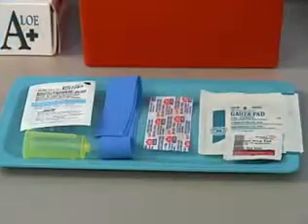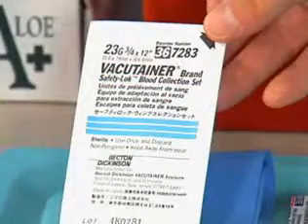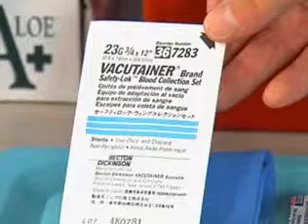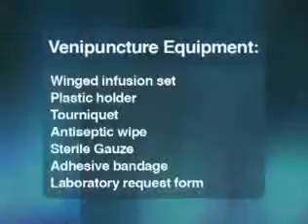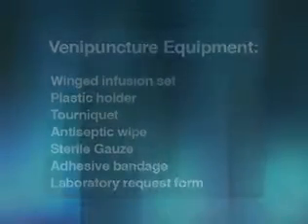Assemble your equipment. To perform this procedure, you need a winged infusion set with a 1/2 to 3/4 inch needle with a gauge between 21 to 23. You also need a plastic holder, tourniquet, antiseptic wipe, sterile gauze, adhesive bandage, and a laboratory request form.